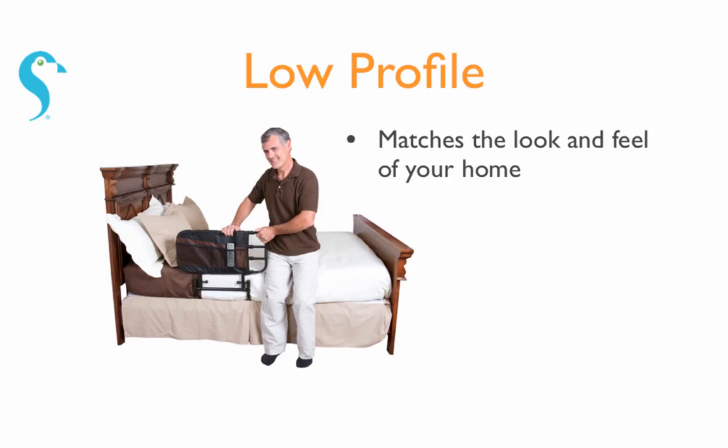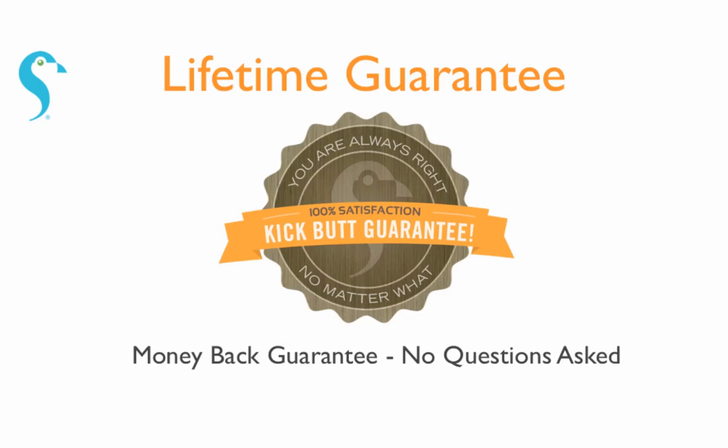It matches well with the look and feel of any home, and as with all Stander products, comes with a lifetime satisfaction guarantee.